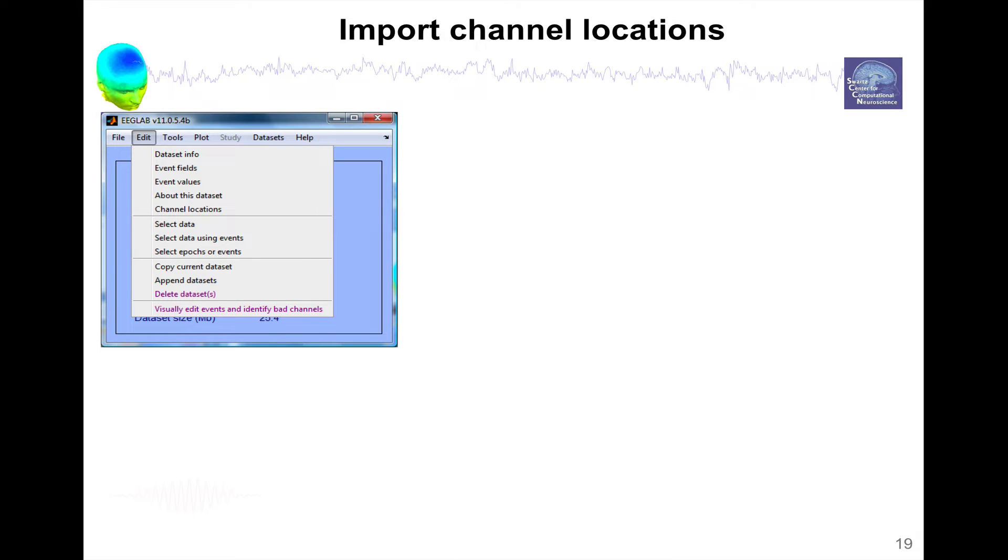To import channel locations, you go to the Edit menu, Edit, and then Channel Locations.